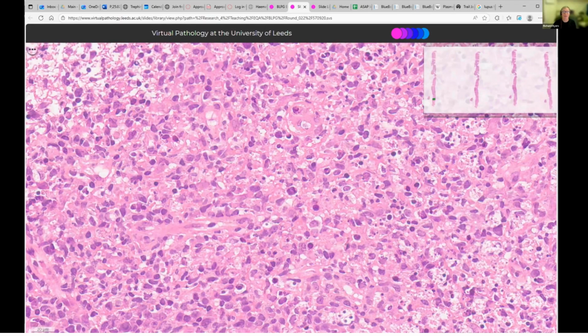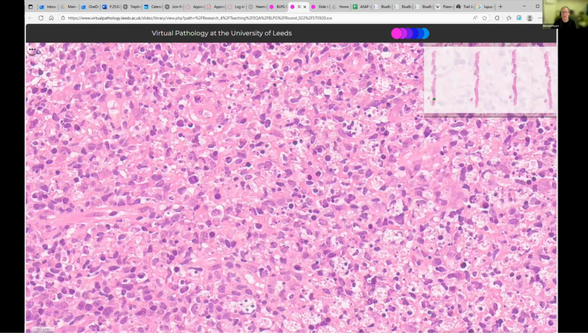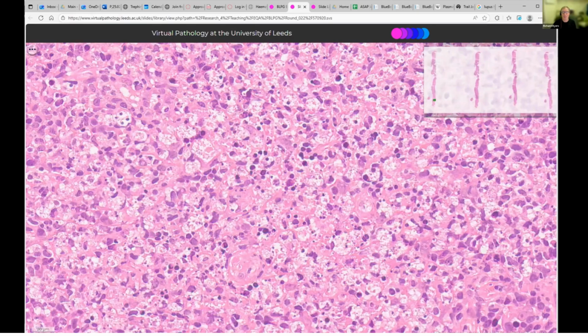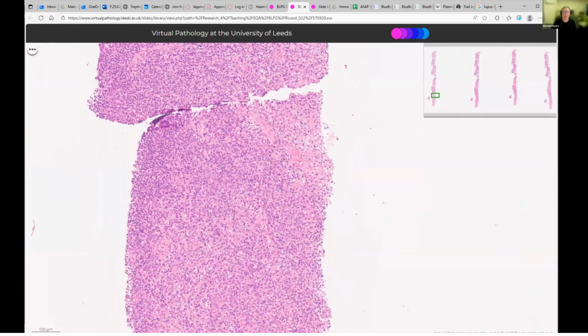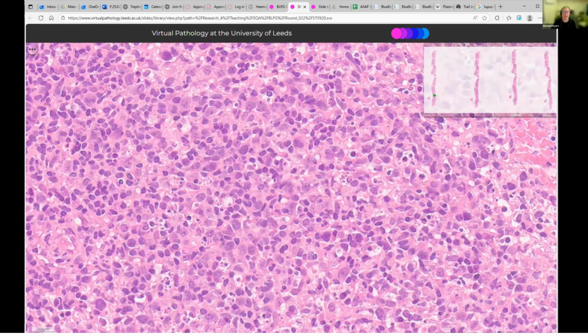But I think if you see these necrotic areas with all this karyorrhectic debris and nuclear dust, plus these florid large areas of immunoblasts, which on their own look really quite nasty, then I think Kikuchi's is more likely. And I think it's also more likely to be unilateral than lupus. So let's go to the immunos for this case.